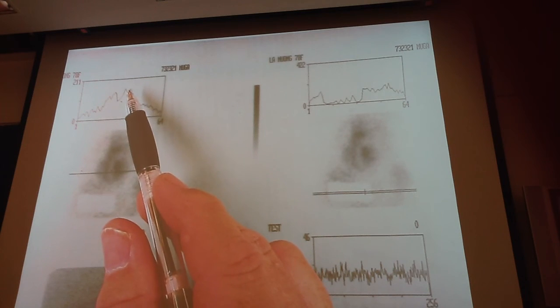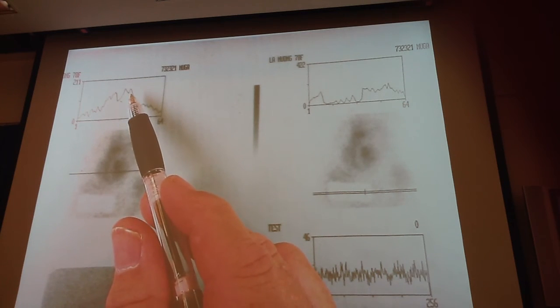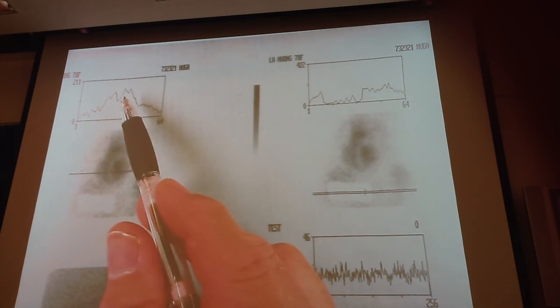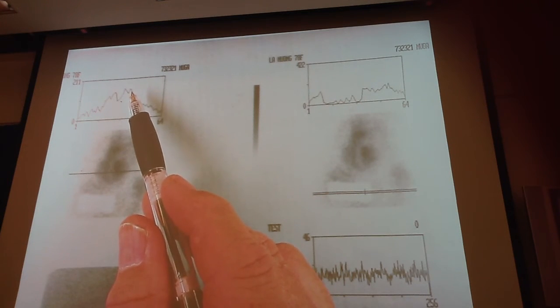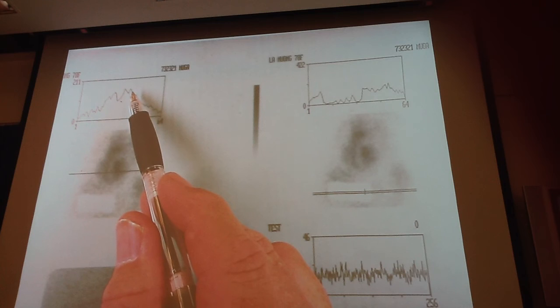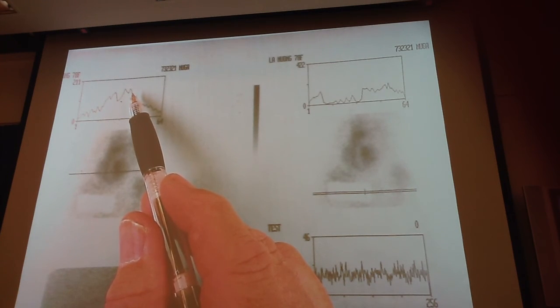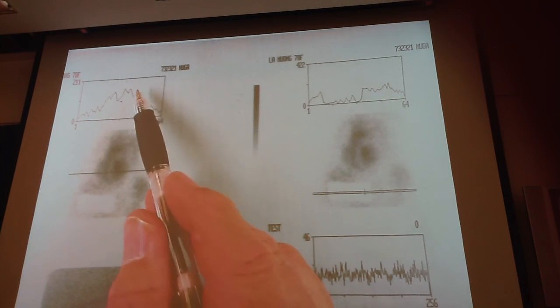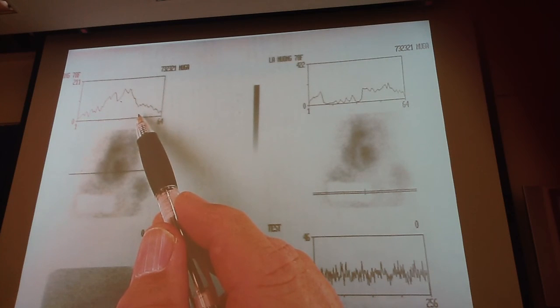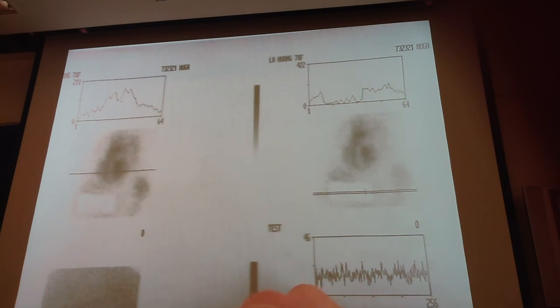So basically it looks at the count rate in this pixel and compares it to the one next to it. That's your first derivation. Let's say that there is a difference of 10 counts between the two pixels. So I've got 100 counts here, and I've got 90 counts next to it. That's the first derivation. To calculate the edge, I would go for the second derivation, and that would be minus another 10. So the first pixel that I come across that has 80 counts in it, the computer says, okay, that's the edge of the heart. Weird, huh?